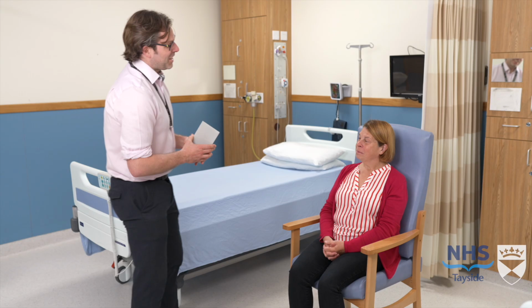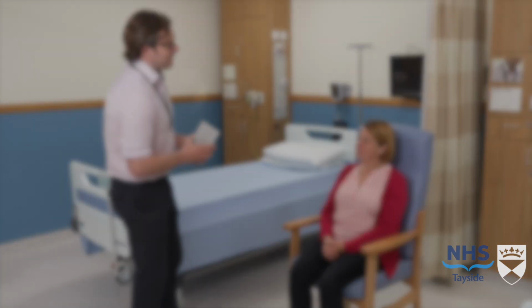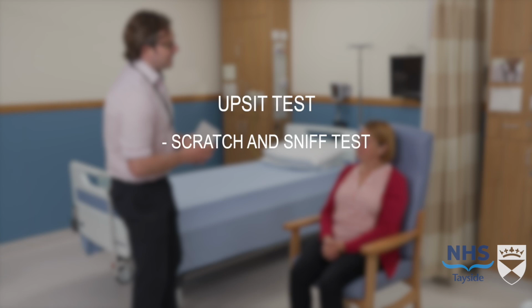Smell testing is easy to perform. For an OSCE, you will likely not be asked to demonstrate this, but should have an understanding of how to do this clinically. There are many methods of testing, but we use an UPSIT test, which is a validated scratch and sniff test with normative data allowing for changes in age and gender.